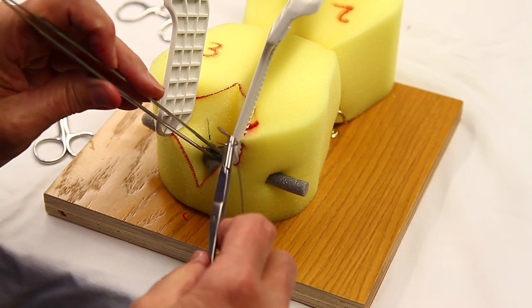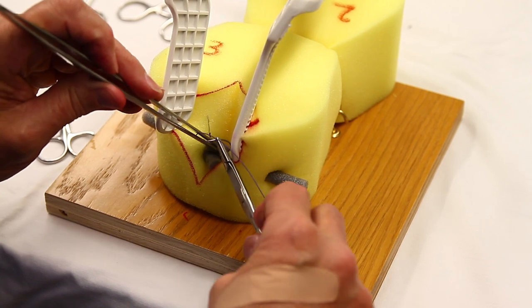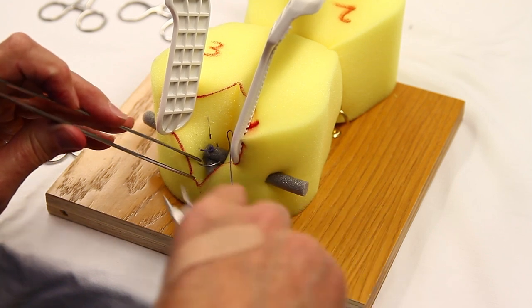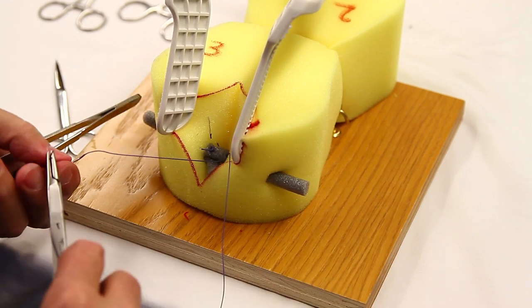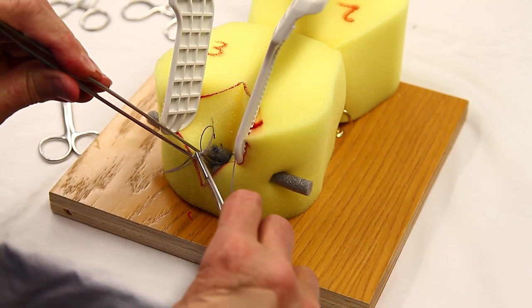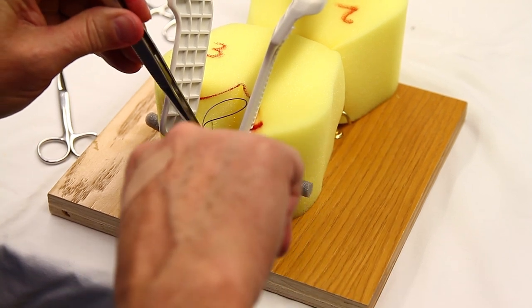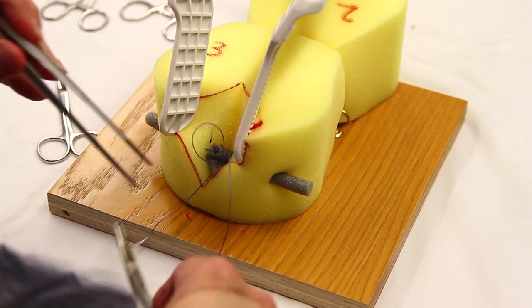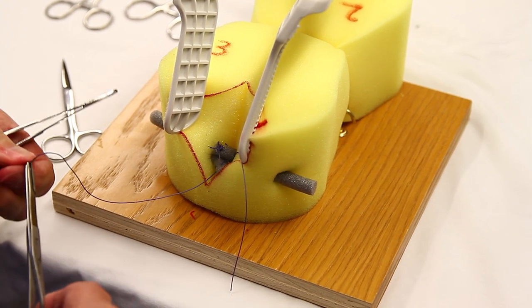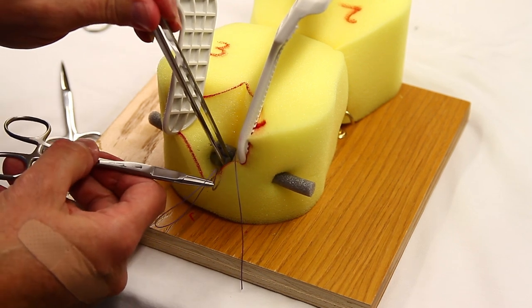We want to put three in so we're going to put one down farther. We're going to bring it through, re-grasp. Good light, good help is very important for this repair. Common third and fourth degree lacerations may take 45 minutes to an hour so adequate anesthesia for your patient is essential.